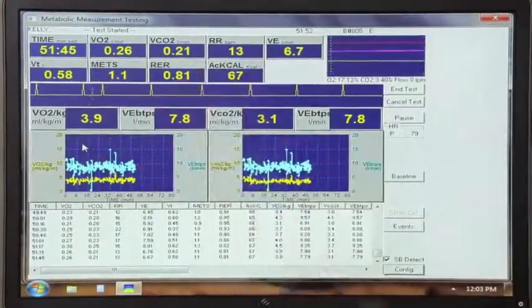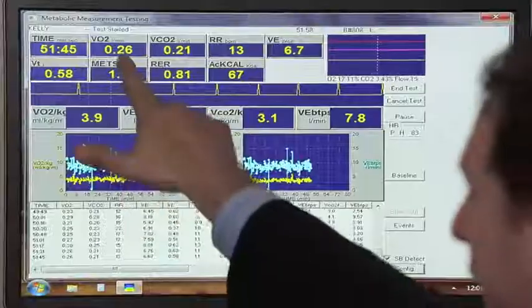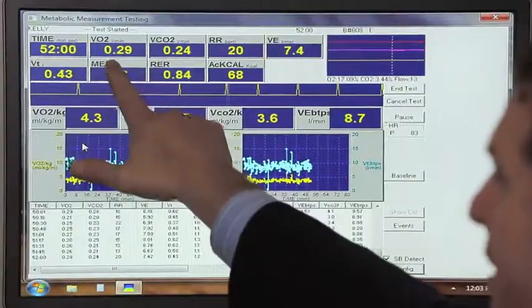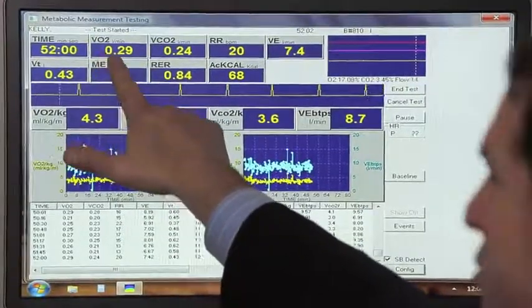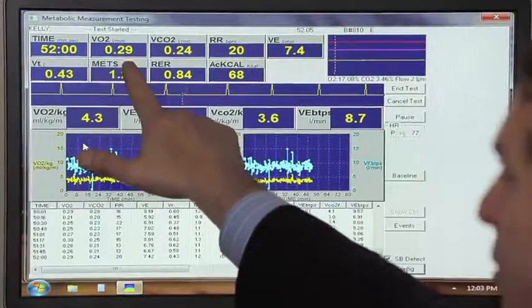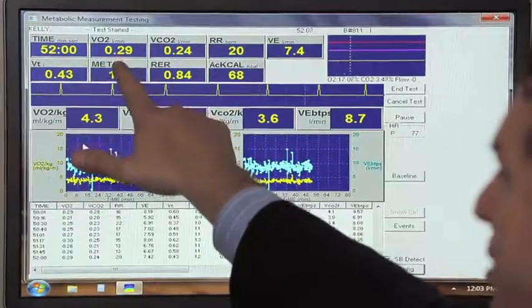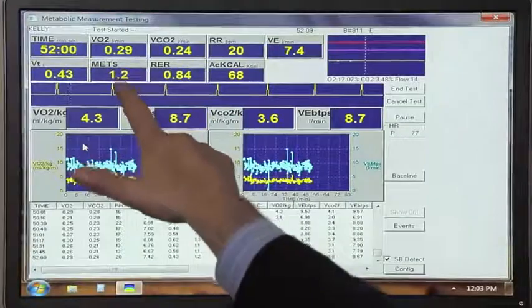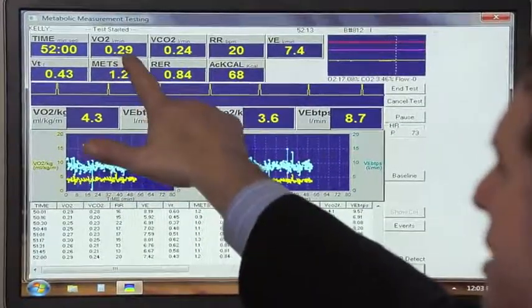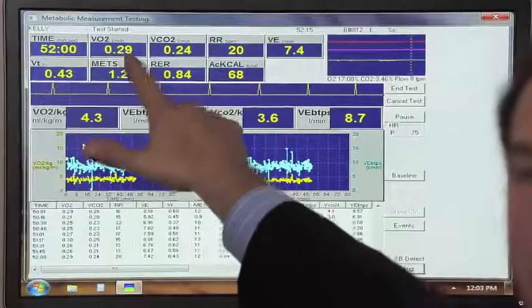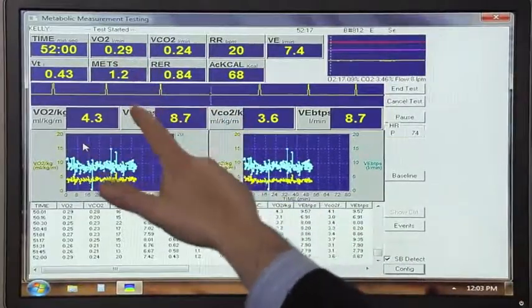We then measure that level of oxygen that she's consuming, which is proportional to how much energy she's producing in her body to make adenosine triphosphate. On this first panel, VO2 means the volume of oxygen she's consuming per minute. At this moment, after 52 minutes of rest, she's consuming somewhere around 290 milliliters, or 0.29 liters of oxygen every single minute.